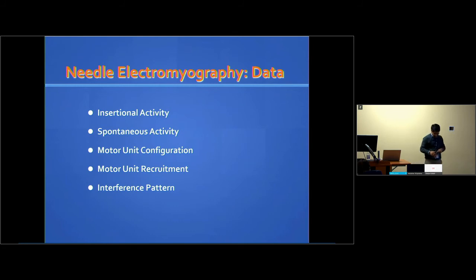If I am picking this up, I am looking at generation of force by the muscles that are involved. If it is creating, say, 2 ounces of force, it may take 10 units, as an example, to give me that. But what if I don't have 10 motor unit action potentials?